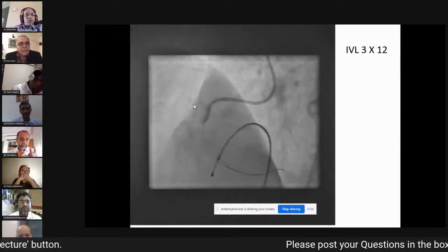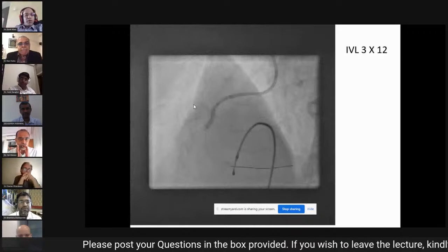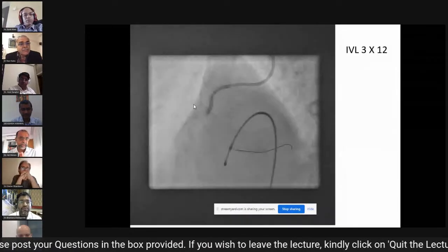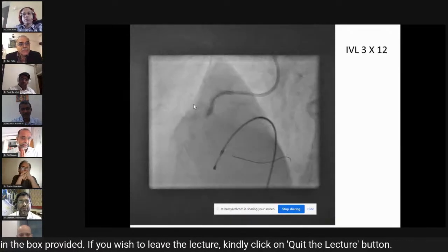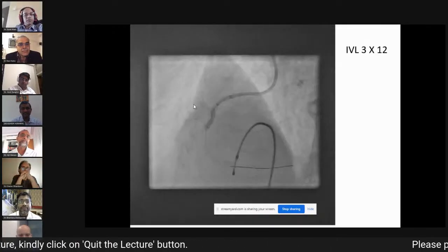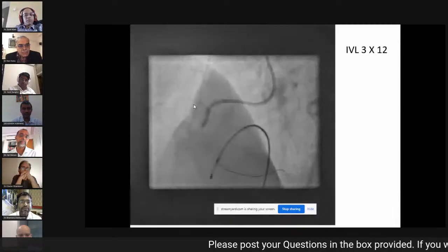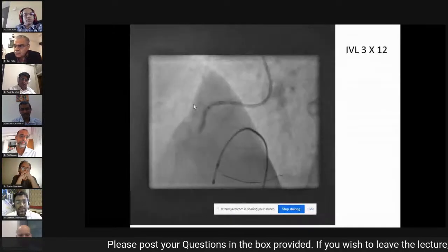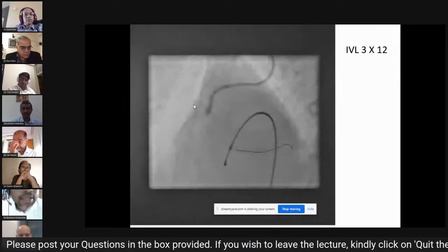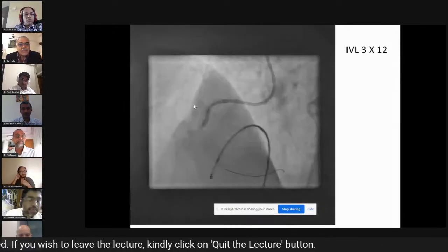So the problem, it might clear the situation. Ashish, one question I have for you: what made you choose an Amplatz guiding catheter in this situation, and not a regular JR4? Yeah, because of the discussion with the previous operator, sir, it was very clear that he used JR and there was a lot of difficulty in support. So that was the secondary reason we went upfront with this guideliner, so he could have put the OCT catheter prior.